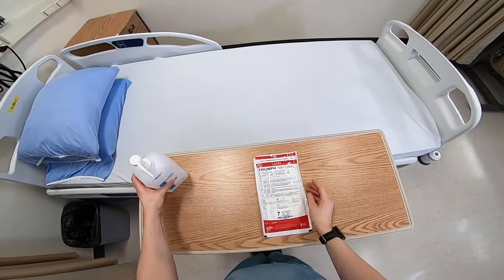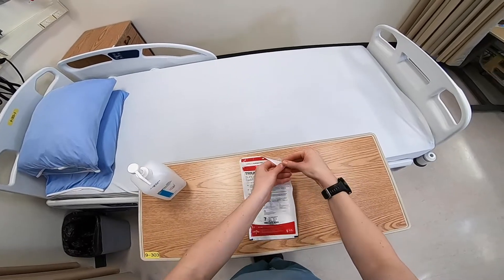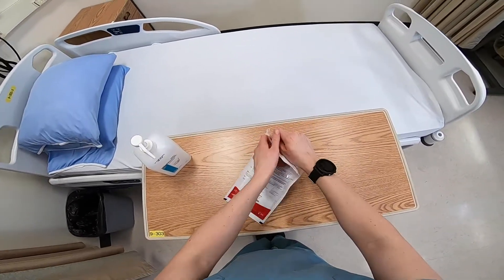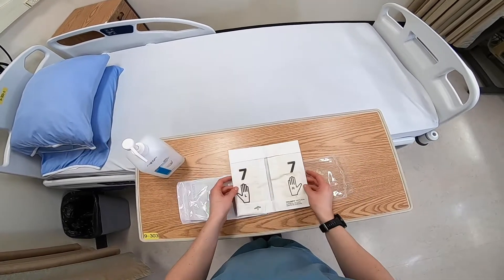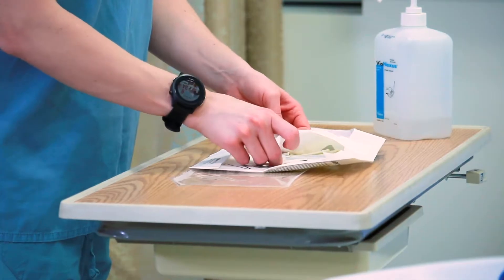Next, open the outer package of sterile gloves on a clean surface. Then carefully unfold the inner package of sterile gloves on a flat surface.